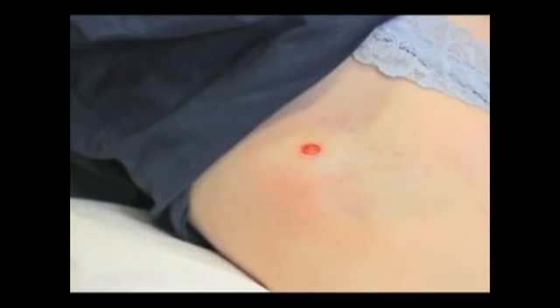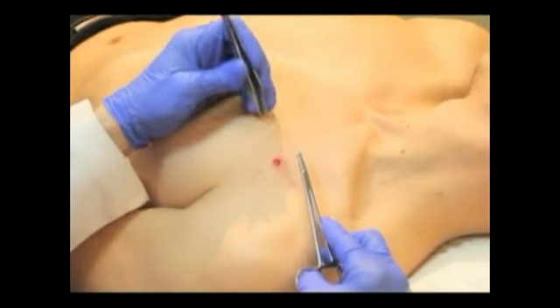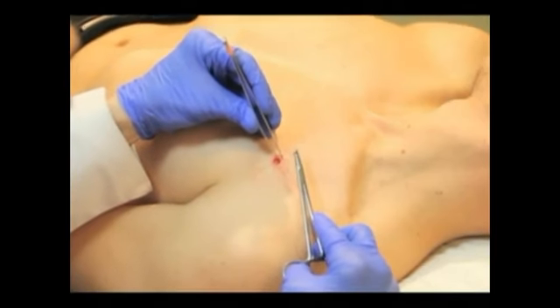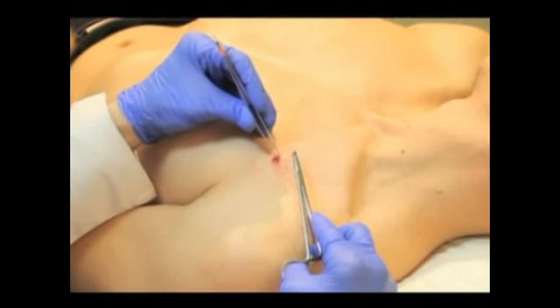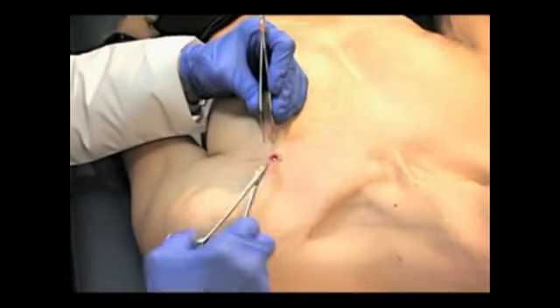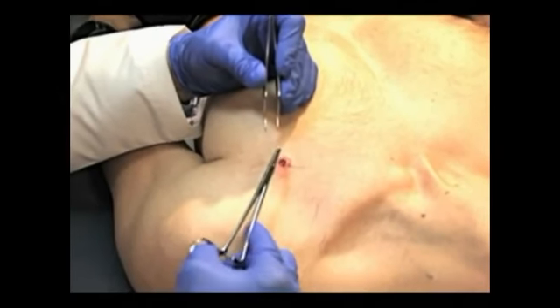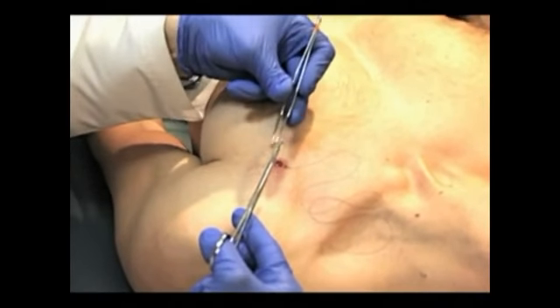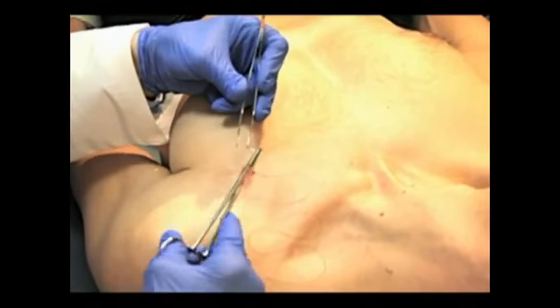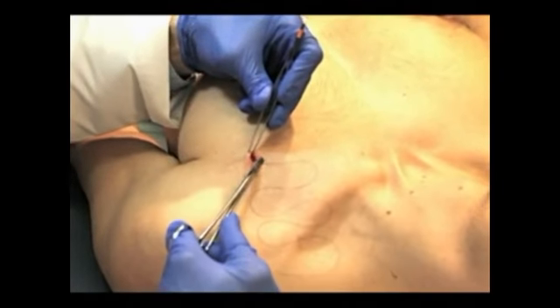When you have finished the biopsy and have obtained the specimen, you may suture the wound. Place the sutures perpendicular to the long axis of the punch defect and/or perpendicular to the skin tension lines. Begin by placing the needle through the edge of the wound. Release the needle and, keeping your palm down, grasp the point with the needle driver. The wrist curves naturally, which directs the blunt end of the needle to your forceps. Reload the needle driver. Next, pierce the opposite edge of the wound with the suture.